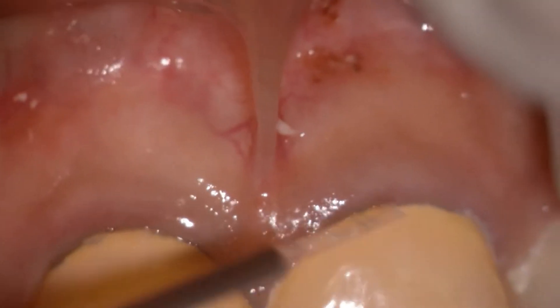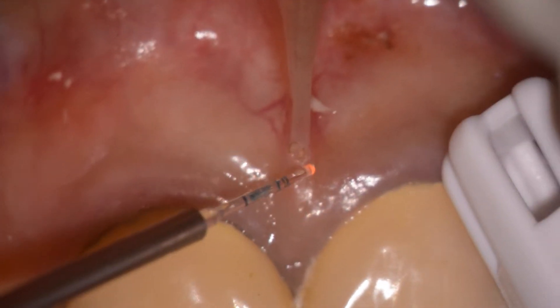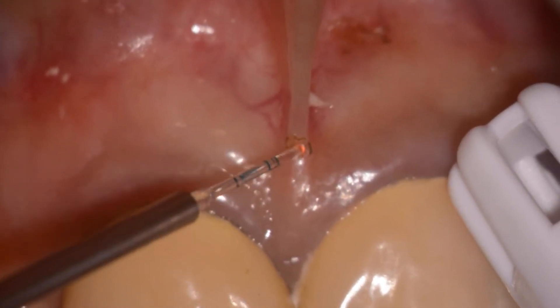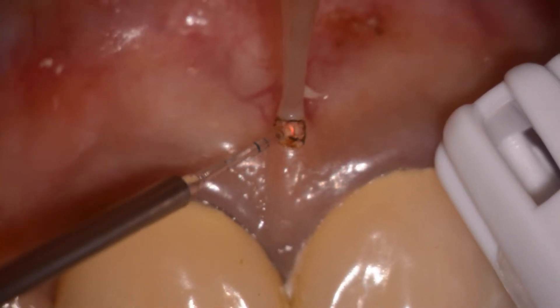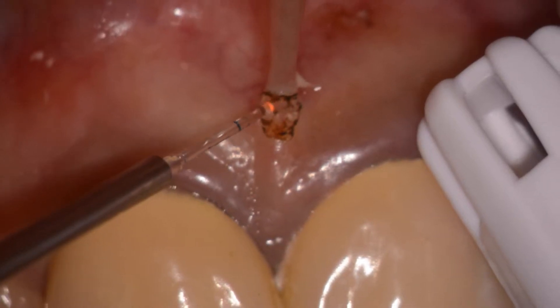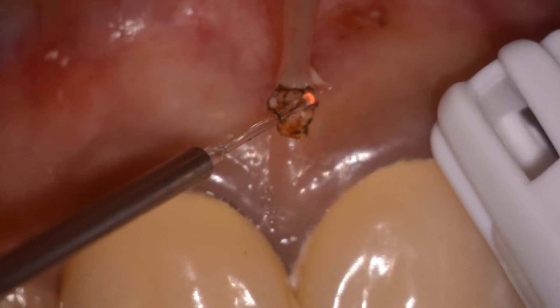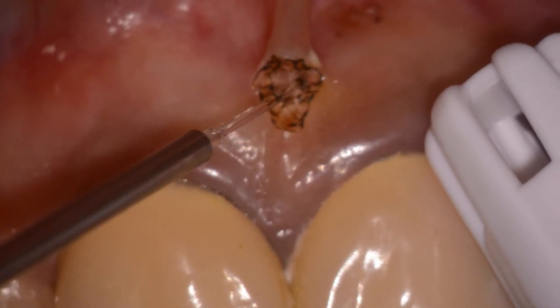You can see the thick frenum here. We put some anesthetic in and we're using an initiated tip because we're in contact. The key to any frenectomy is to use your non-dominant hand — your left hand — to pull the lip taut and use small touching motions, which will rupture the fibers and allow the frenectomy to suddenly open up, as you see here, in a diamond shape.